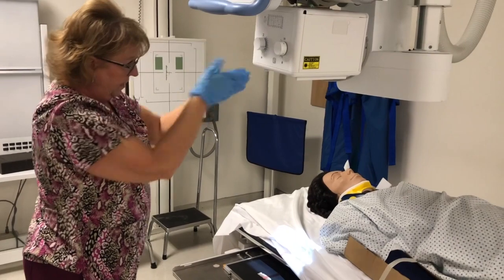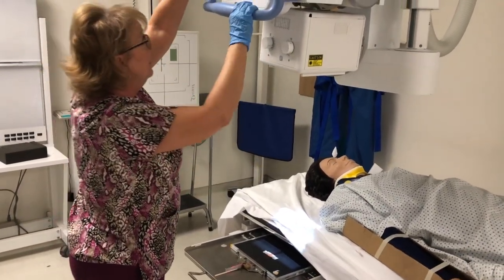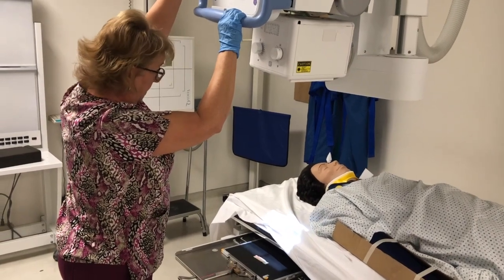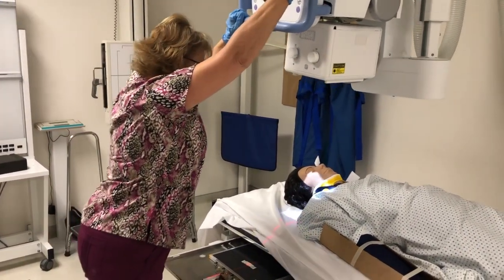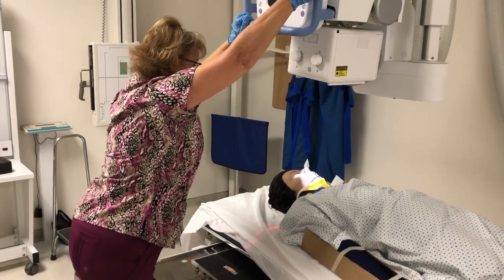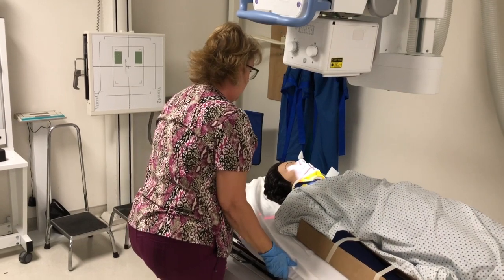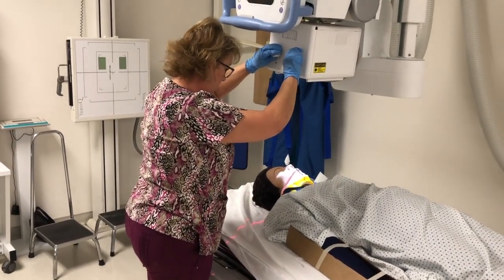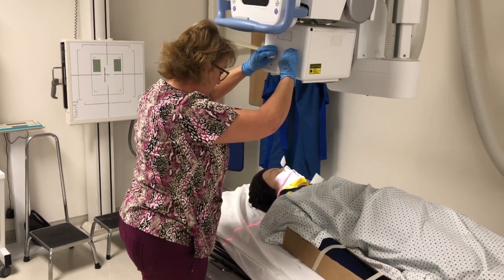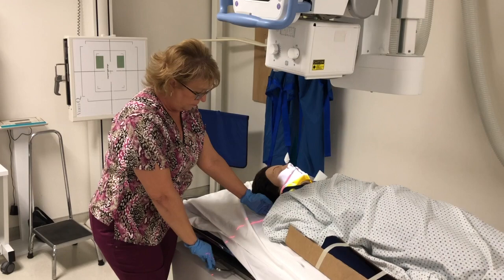Okay, once I have established that I'm parallel with the occlusal plane, then I would center and then collimate down to just the odontoid. I've left it open wide enough to include my marker that I've placed down here.